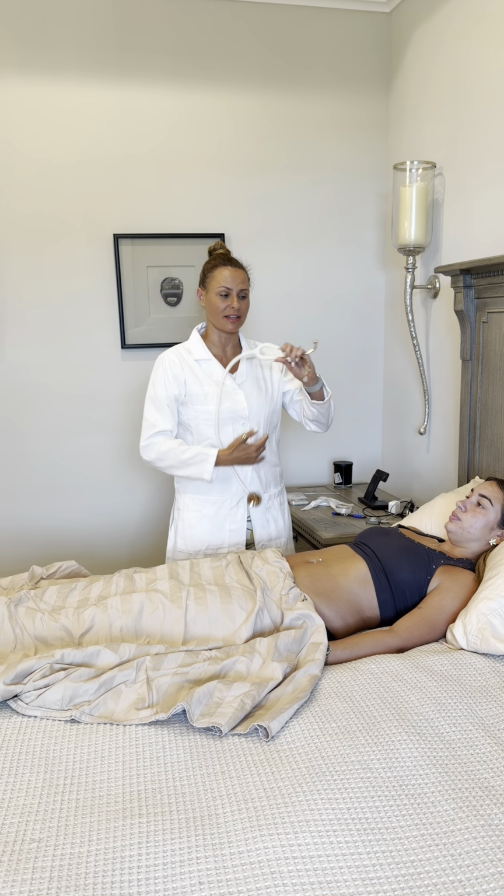Perfect, no bruit heard there. Next, we're going to be moving on to the renal arteries, which are branching off of the aorta to the right and to the left. The same thing, I'm going to be listening for bruit there. We're still above the level of the umbilicus at this point. Perfect, no bruit as well.